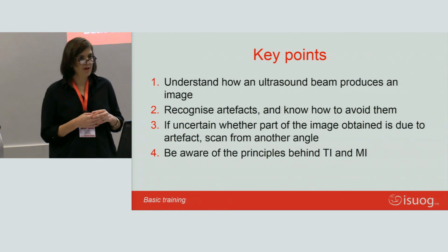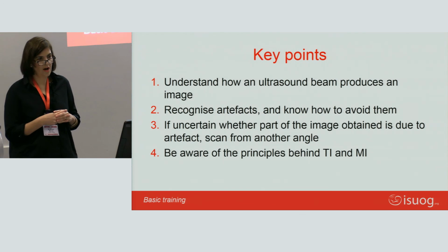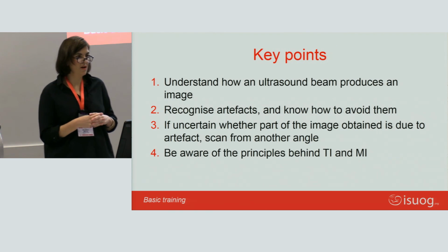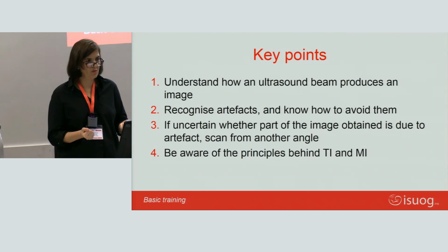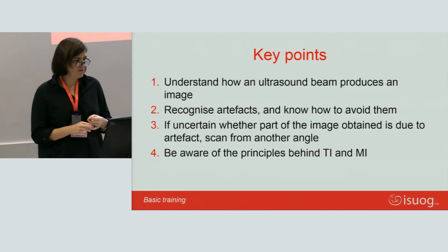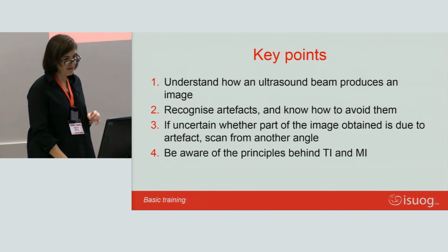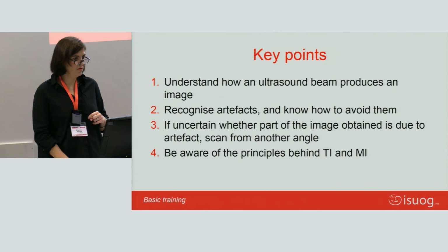So I hope you understand how an ultrasound beam is produced. I hope you know how to recognize artifacts now and how to avoid them. If you're uncertain about whether you're obtaining an artifact or whether what you're seeing is real, change the angle of insonation, and always be aware of how much time you're exposing the fetus to and the mechanical and the thermal index.